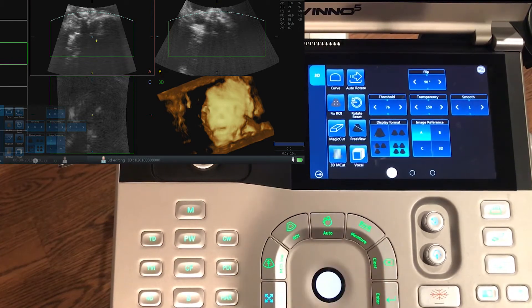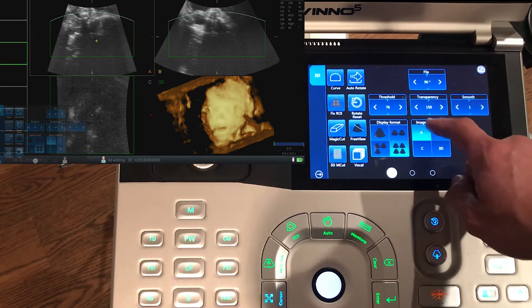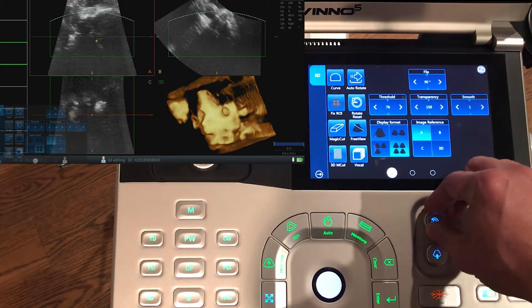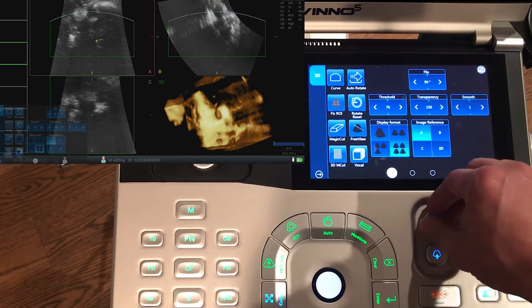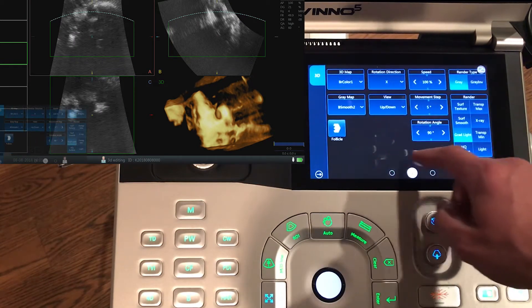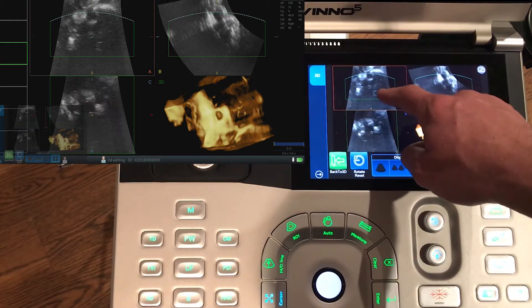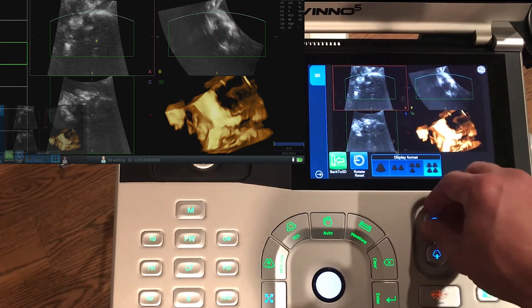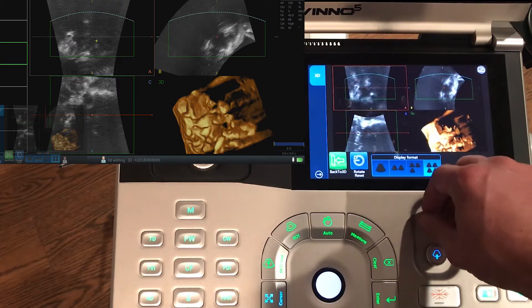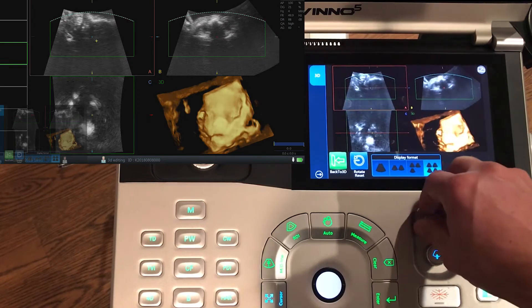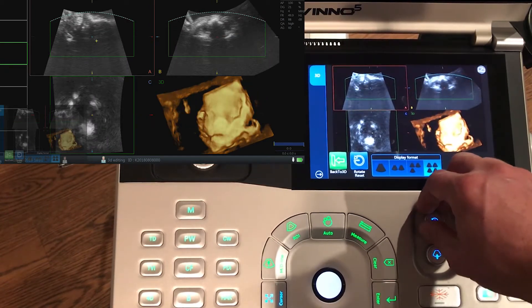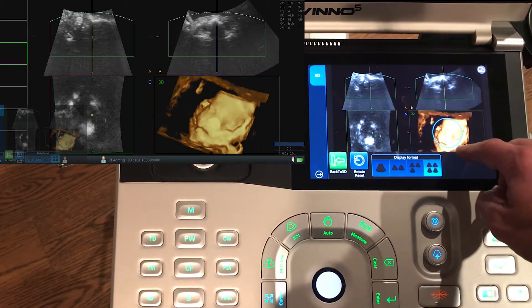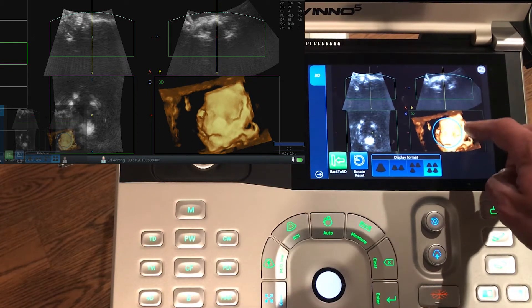The first thing I'll try is to go to the A image and just rotate using this knob to see if I can move around and get any kind of appearance of a baby face or a profile. I'll slide this down a little bit and just keep rotating. Sometimes that helps, but in this case we're really not getting anything better than what we had originally. I can see from the 3D image that we can see something, so let's see if we can improve it from where we are.